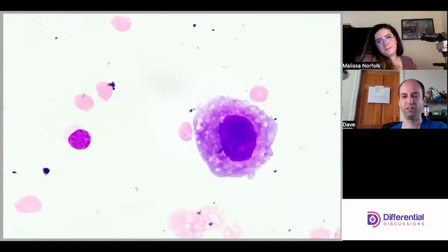But this cell is ugly. The nucleus is really dark. It's hard to see the real characteristics in the nucleus, although it looks like there could be nucleoli, but it's almost impossible to tell.